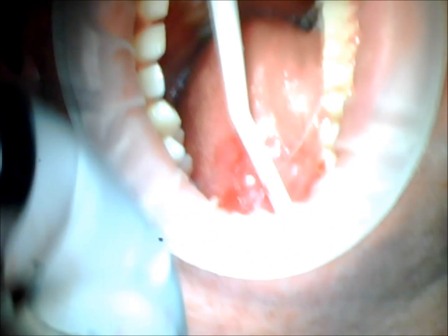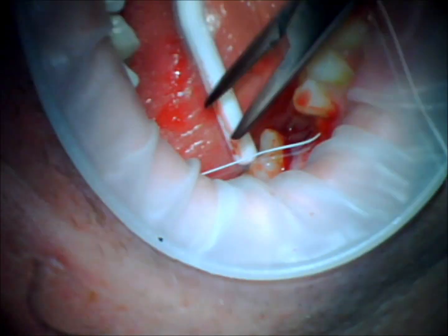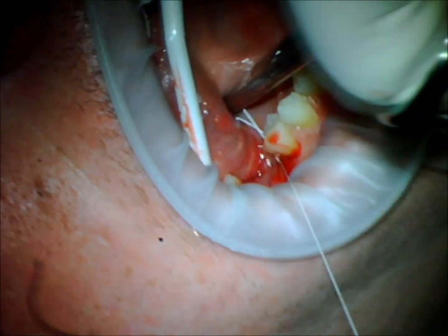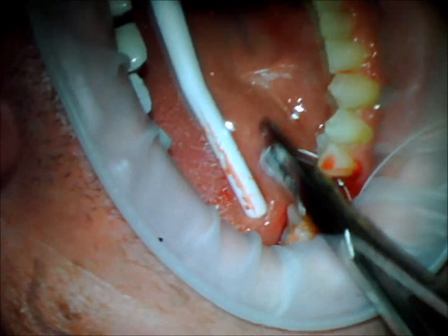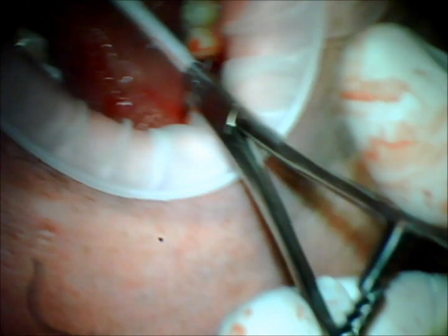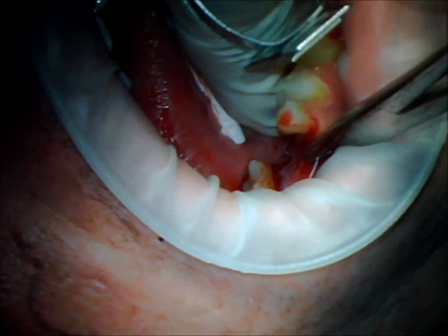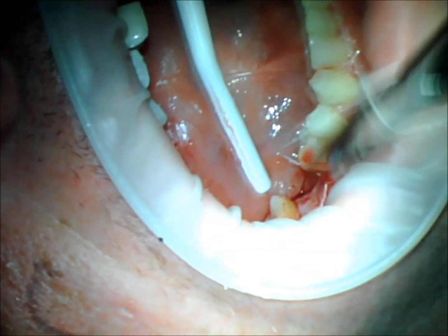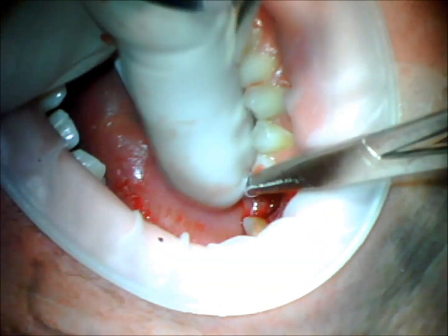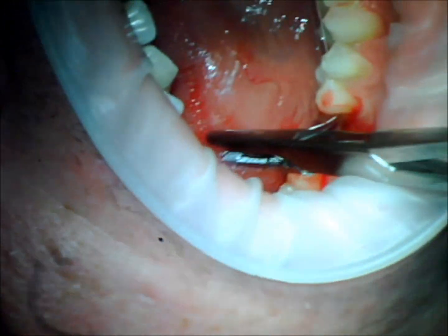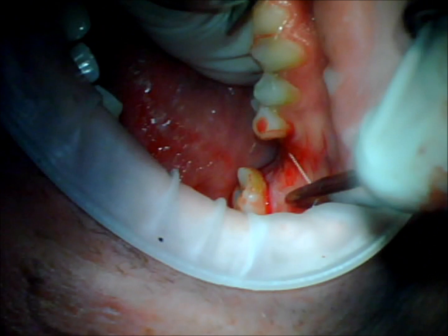These are Cytoplast PTFE sutures available from Osteogenics — probably my favorite suture to use. I threw the first knot; I'm not terribly concerned that it's completely seated because when you come back with this kind of suture and throw your second knot, it will actually cinch the first one down very nicely. You get a good snug fit down on the tissue. The other thing I love about these sutures is that the tissue just heals like they're not even there — they are really inert, very tissue friendly. They're worth the premium price.